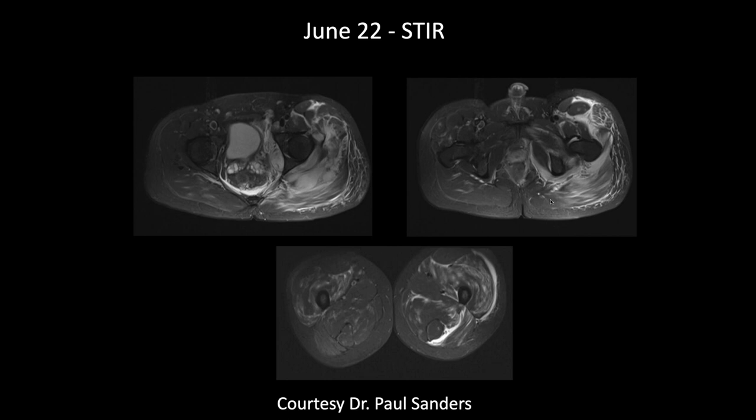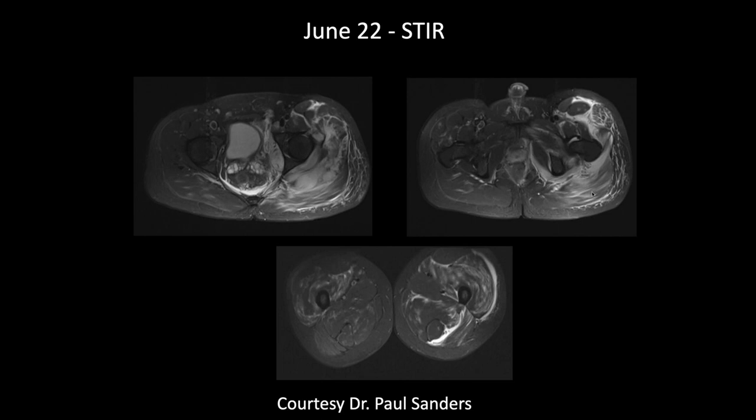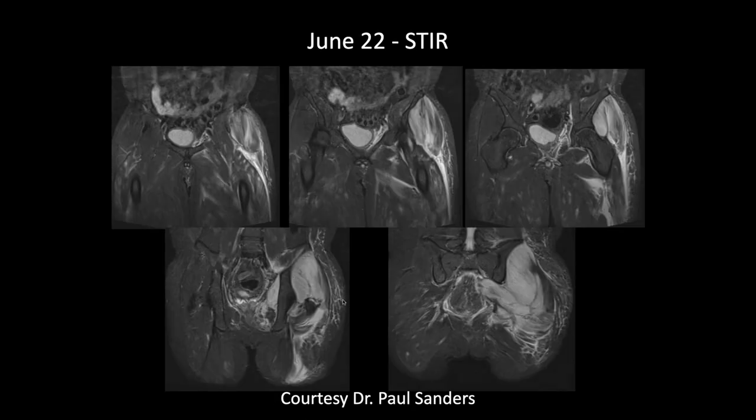Okay, so there's diffuse intramuscular edema throughout the left proximal hip and thigh musculature. It's in multiple compartments. But there's also, on that last image, some less extensive edema on, is that on the right side, or is that just a little lower? On the bottom image, it looks like there's also some in the right side, which makes me think this is something more systemic but greater on the left than the right.